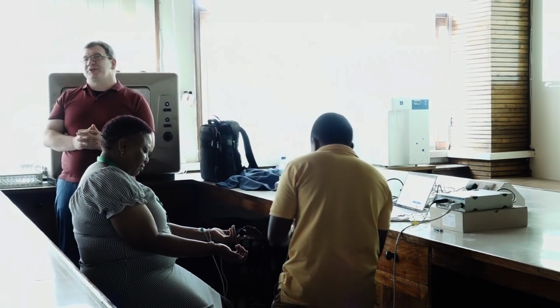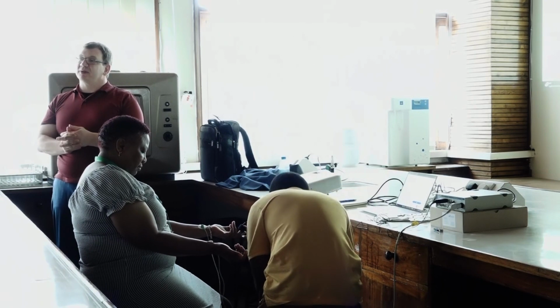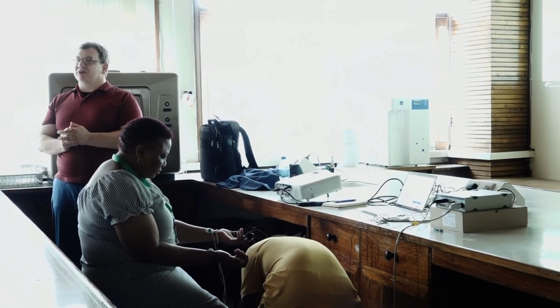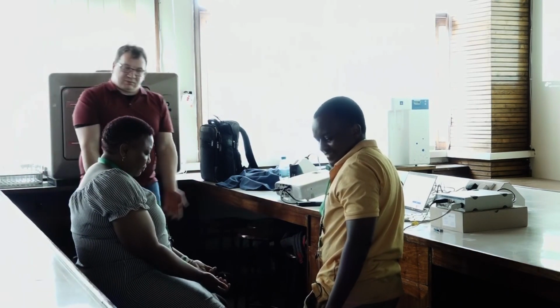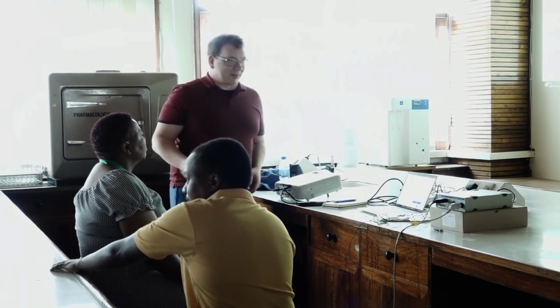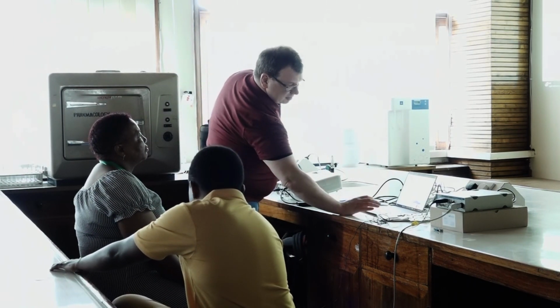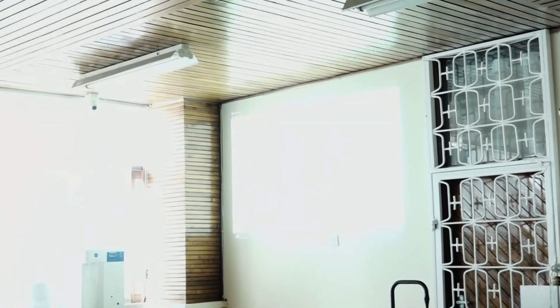Is there anything particular in relation to ECG that you're interested in, either from a research point of view or education point of view? Just put it down as relaxed as possible, because when you hold it, the tension of the muscles might interfere. Thank God she's alive as well. Now you can see some laughing. That's better.